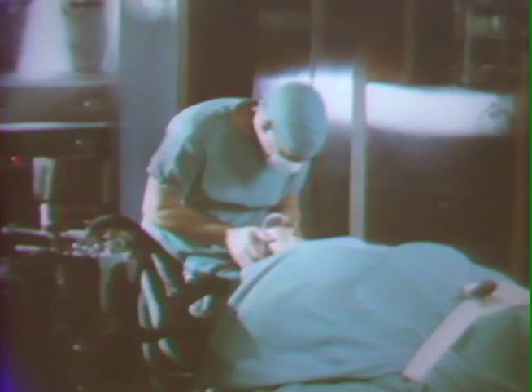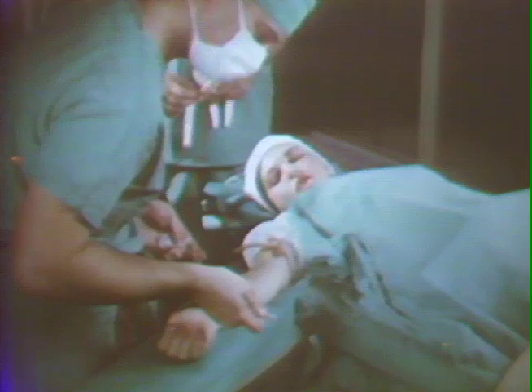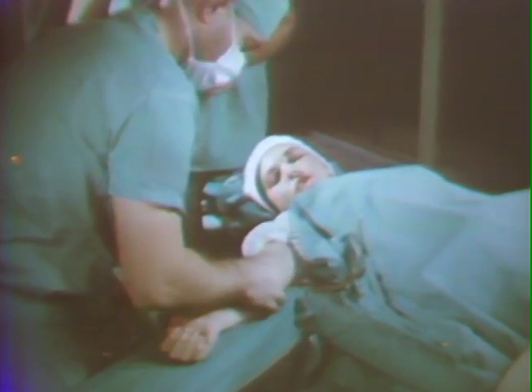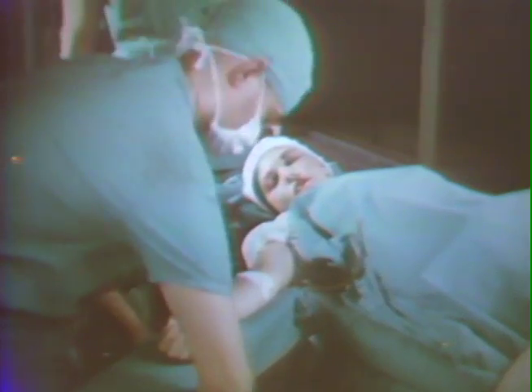The anesthesiologist supervises the positioning of the patient on the operating table and the application of a restraining strap. The arm is placed on a padded board and prepared for venipuncture. Following the insertion of the needle into the vein, the needle is securely fixed to the arm with adhesive tape. The arm is then strapped to the board.